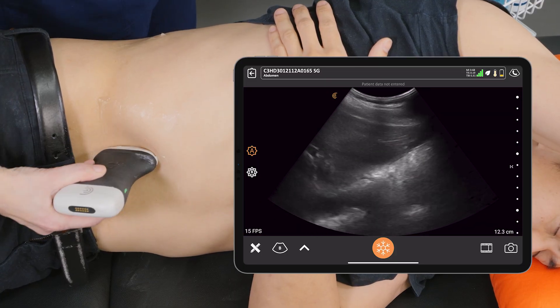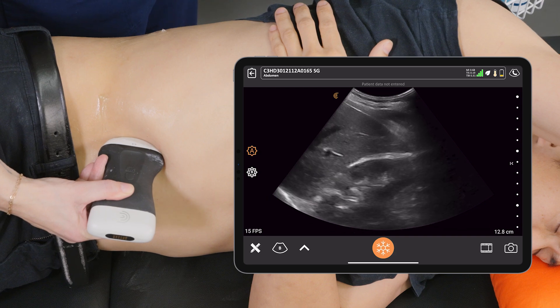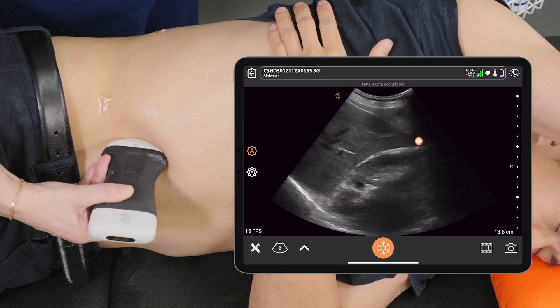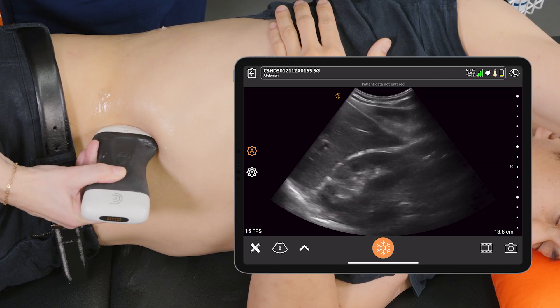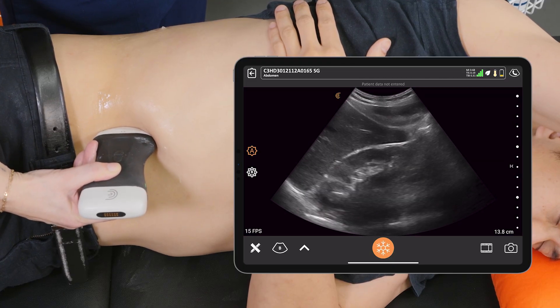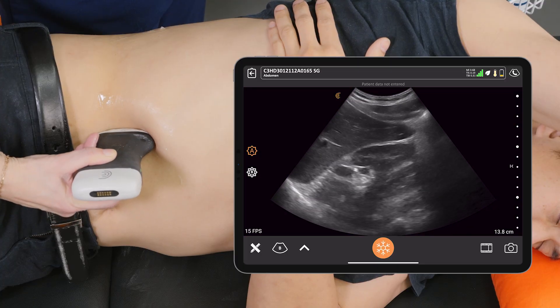We can also use the liver as a window, as it provides us with a nice clear image of the kidney. Again, take a deep breath in and we'll scan all the way anteriorly and posteriorly in sagittal.